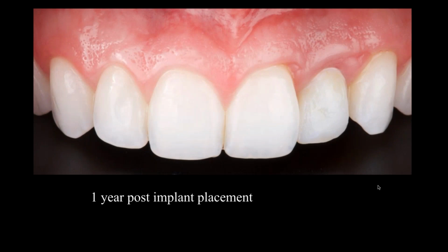So here she is, just about ready to be restored. She's got a little bit of soft tissue maturation occurring. He's going to change the sulcus underneath that a little bit to build it out. And so she's looking a lot better. She thinks it's pretty good.